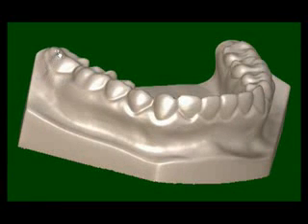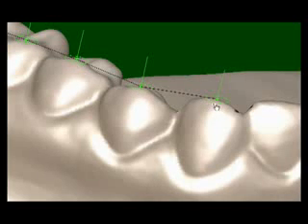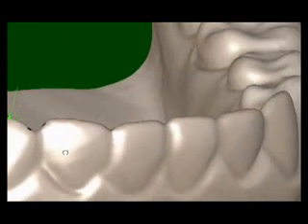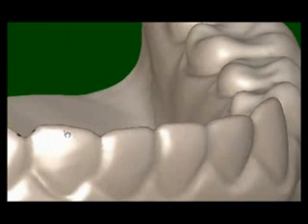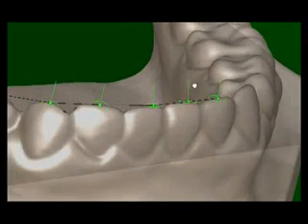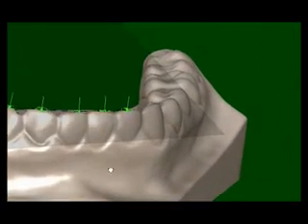Next, contact points are defined. As the designer clicks on the model, software automatically repositions the points to the highest location on the tooth with respect to the occlusal plane. An island area is defined at the contact point. A smooth plane is passed through the islands to form a contact surface. A portion of this plane becomes the splint surface.